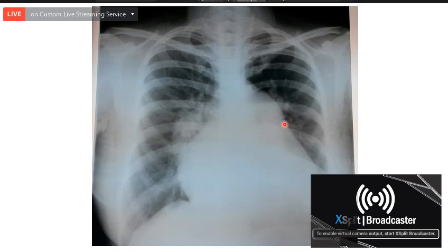End on vessels will not tell you about pulmonary hypertension. End on vessels will help you to diagnose pulmonary plethora, the shunt lesions. There is increased pulmonary plethora associated with the end on vessels, and that is suggestive of shunt lesion.